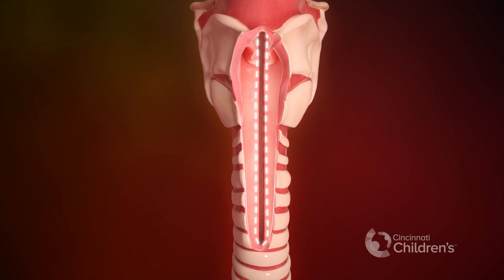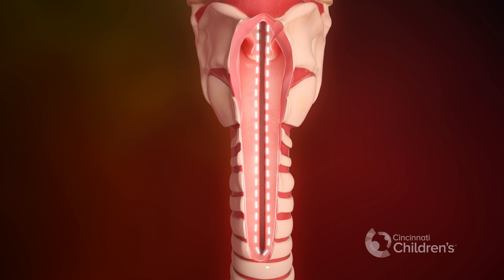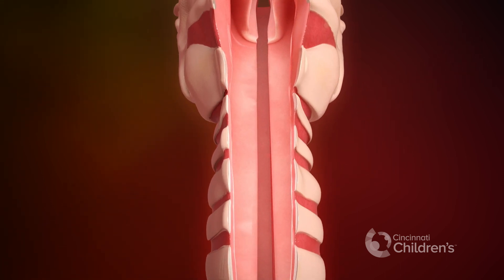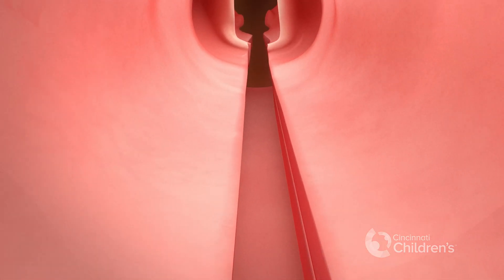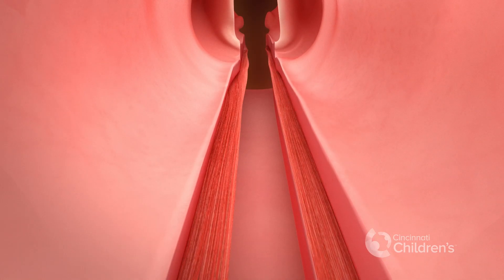The cleft is visualized in its entirety. Mucosal flaps are elevated along the length of the cleft to separate the esophagus from the trachea and the larynx.